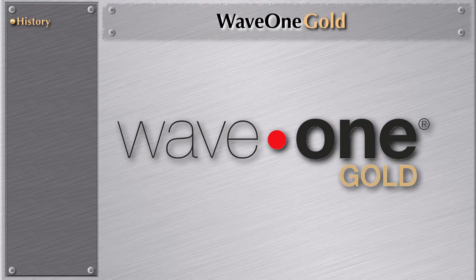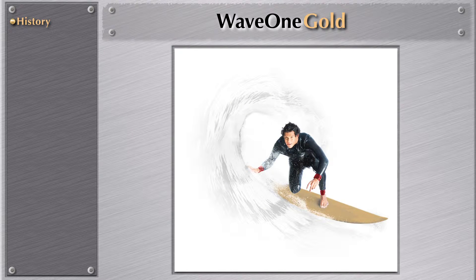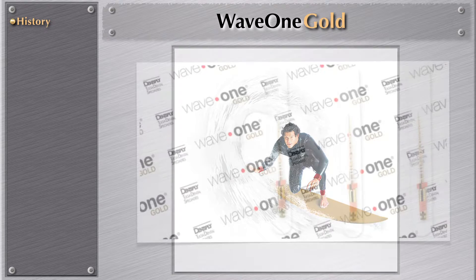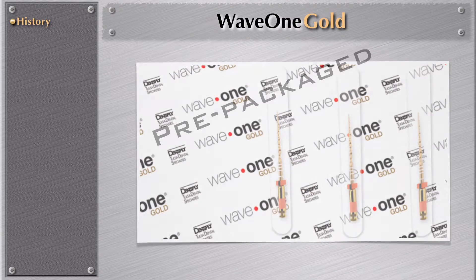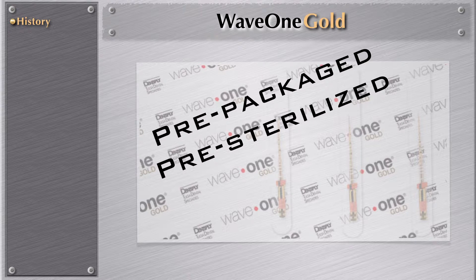WayOne Gold has remarkable improvements over WayOne. These are the files — WayOne Gold. It comes in a pre-package, like any other instrument, pre-sterilized, which is very important. Most instruments nowadays on the market you have to sterilize, but WayOne Gold, like WayOne, comes pre-sterilized. There is no need to sterilize this instrument.